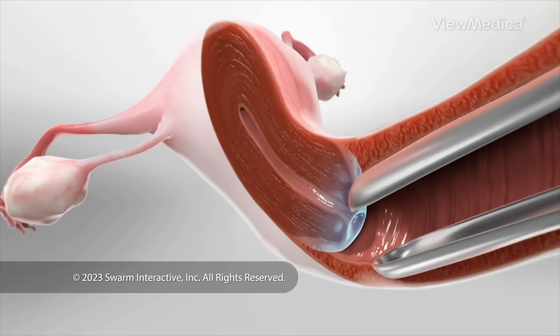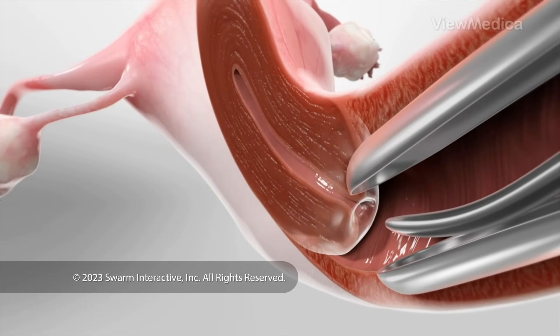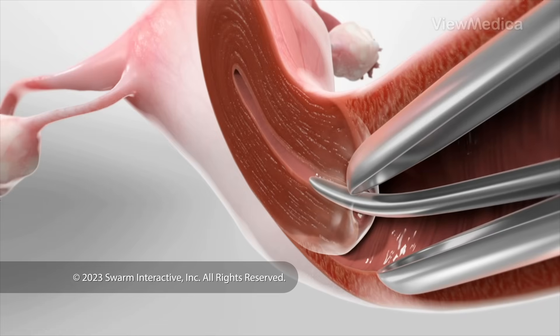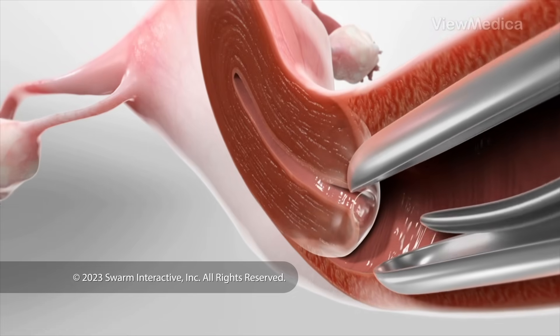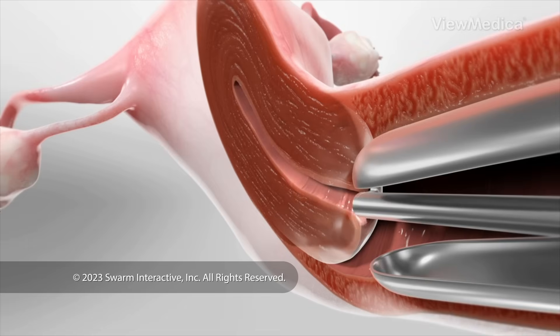We may also need to enlarge the opening in the center of your cervix. We do this with a thin rod called a dilator. Now it's time to treat your uterus. We do this with the help of a device called a hysteroscope.